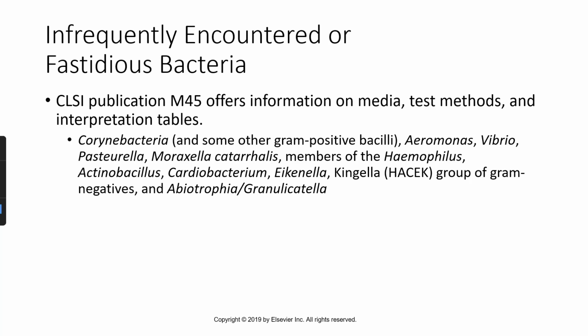Infrequently encountered or fastidious bacteria. There's a list of bacteria that CLSI gives us guidance for, but these are not frequently encountered. We would usually reference protocols if any of these are encountered in the clinical lab.